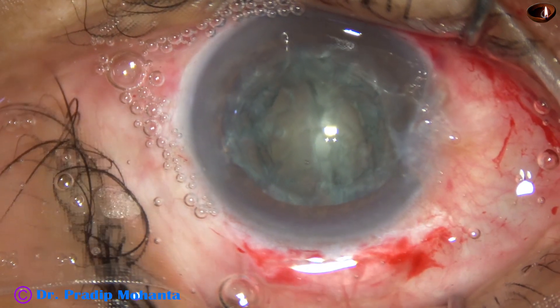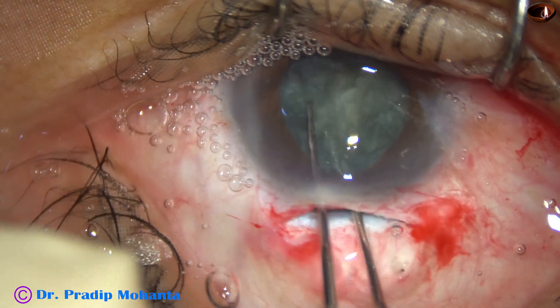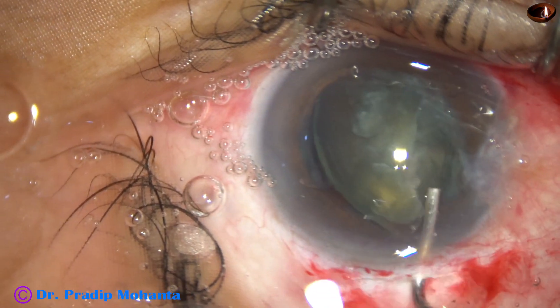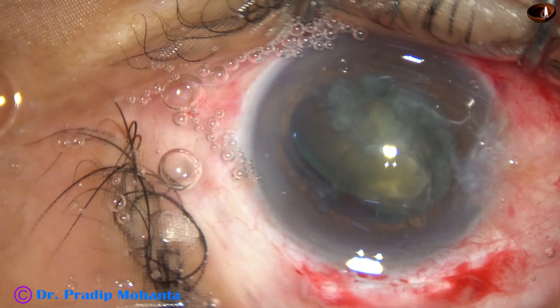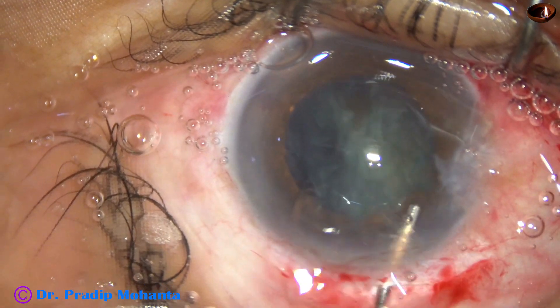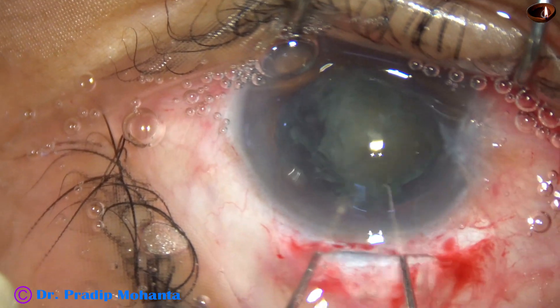Visco is injected. Now I take two Sinski hooks and bring out one heminucleus out of the bag. The other heminucleus is still in the bag. Inject some visco both on the sides, above and below, and then use a fish hook made from a 30-gauge cannula to remove this heminucleus. Inject visco again, use the two hooks again, and bring it out.